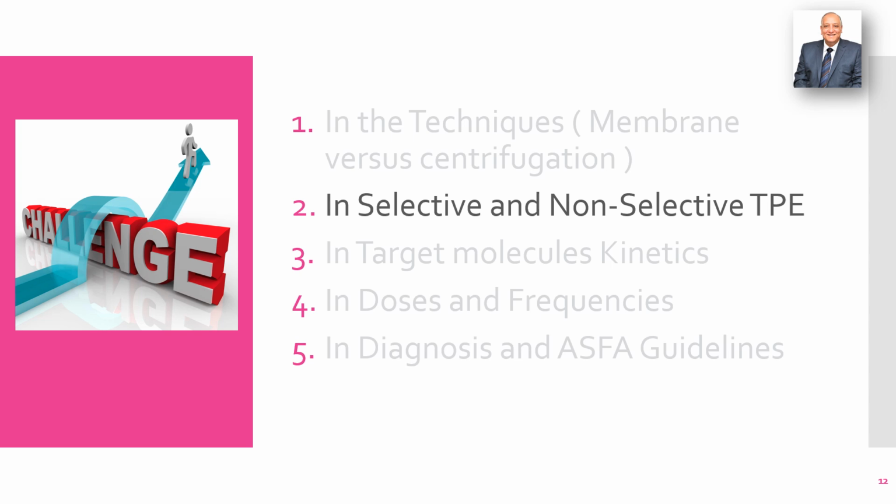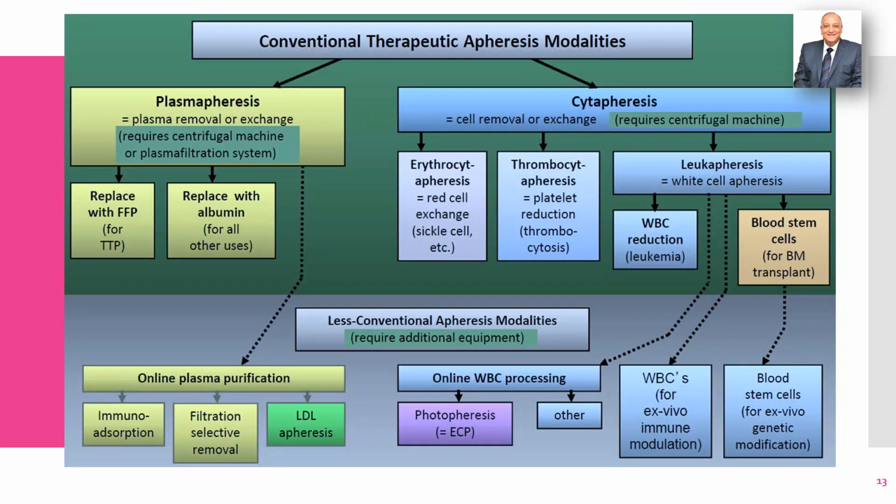Challenges in selective and non-selective plasma exchange. In non-selective therapeutic plasma exchange, which is the commonest way we do it for patients, we are targeting plasma removal or exchange with replacement of fresh frozen plasma or albumin.